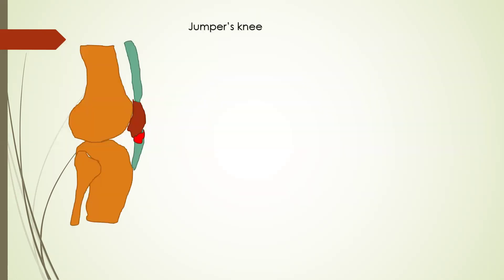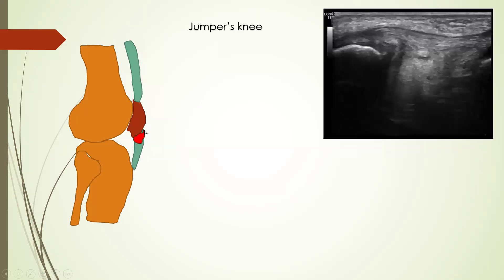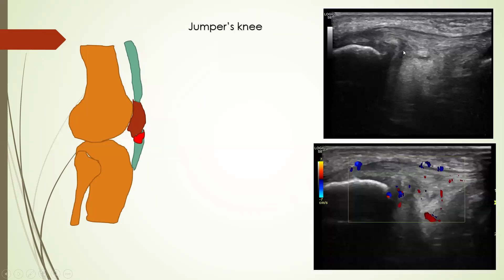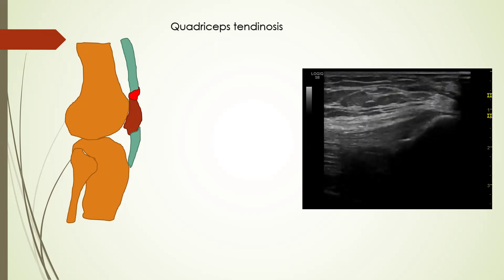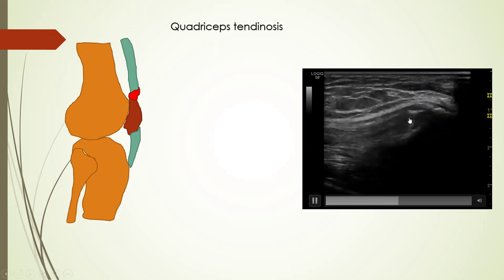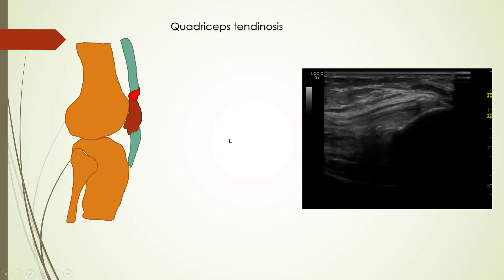Next is jumper's knee, which is focal tendinosis of the proximal patellar tendon. It is seen in athletes involved in jumping activities. Here we can see the proximal patellar tendon is thickened and hypoechoic with presence of vascularity. Similarly, quadriceps tendinosis is inflammation of the quadriceps attachment over the patella, where we can see a hypoechoic tendon with or without presence of calcific foci.